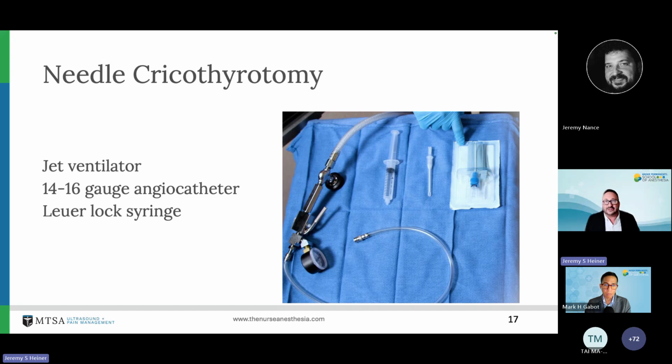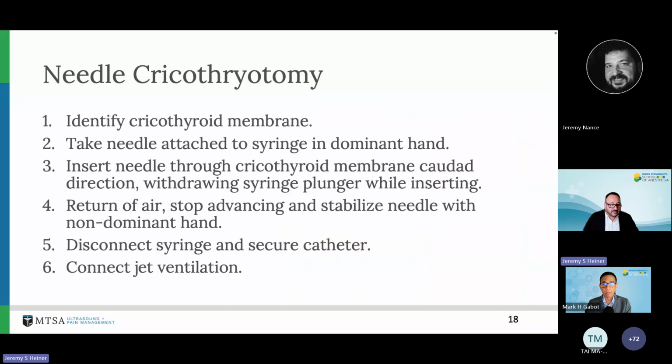And if you're going to be at least remotely successful at ventilating, then you really do need a transtracheal jet ventilator to access the amount of pressure that's needed to get through that small catheter. So unless you know exactly where that transtracheal catheter is and how to set it up, it could be challenging when doing a needle cricothyrotomy.